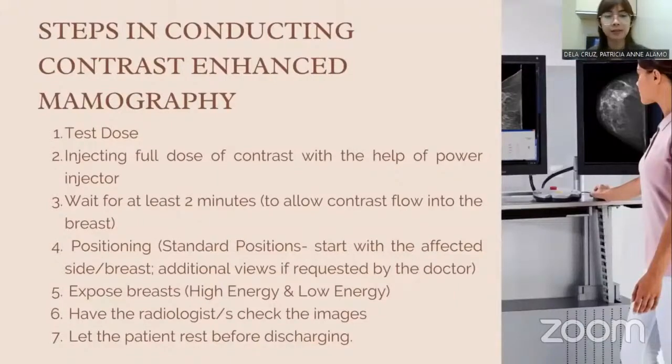Then we will expose the breast with high energy and low energy. Don't release the exposure button until it's done, because some radiographers forget to hold the exposure button, and there are two exposures, the high energy and the low energy. Have the radiologist check the images before discharging the patient. Of course, let the patient rest before discharging and observe for any post-procedural symptoms or allergic reaction.